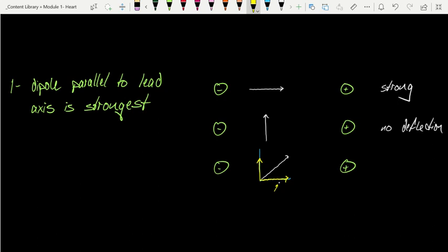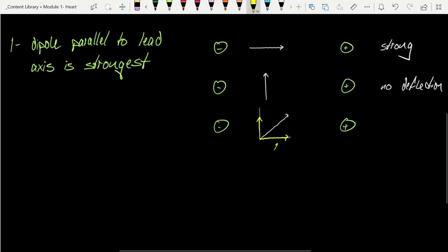Now, just to highlight why that's important, let's do another scenario. Again, set up our perpendicular axis and our parallel axis, and another arrow that say looks like that. Most of this arrow is actually perpendicular, so the full magnitude, the strength of this is going to be lost. But are we going to see something?